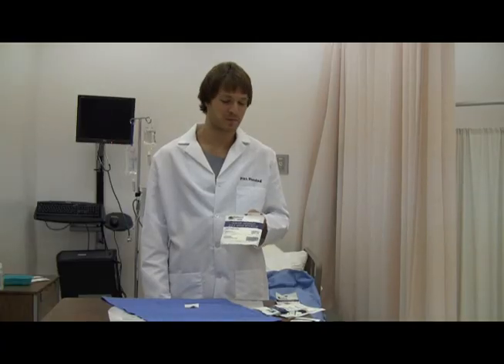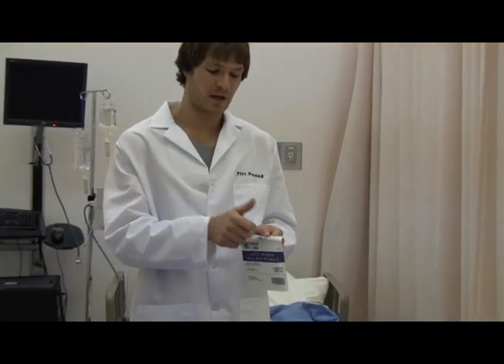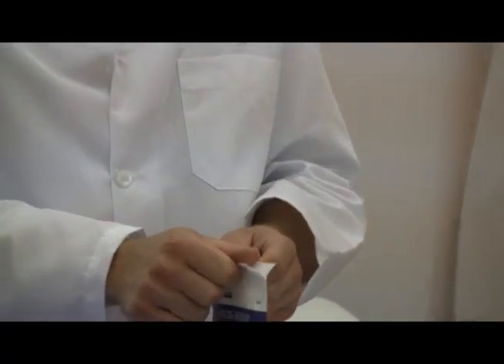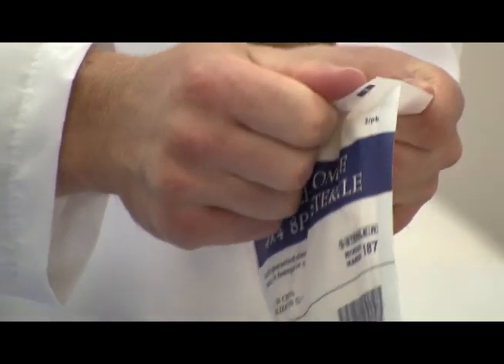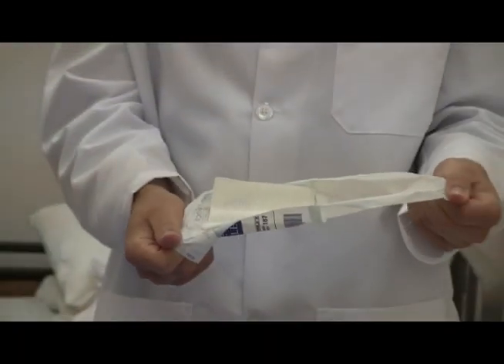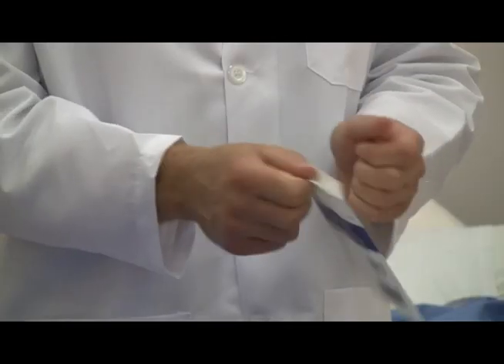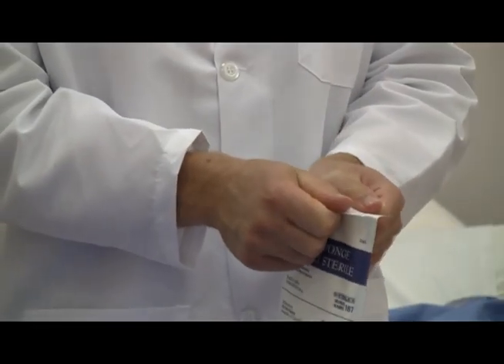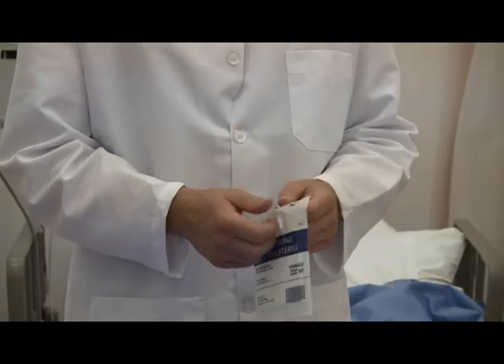Alright everyone, now we're going to practice with our 4x4. Again, it opens from the top. Take your two thumbs along the crease, gently pull apart, like so, then pop it into the middle of the sterile field. Take one thumb, the other thumb, and gently pull apart, and if you break it, you have to start over. So you're going to get another 4x4 now.